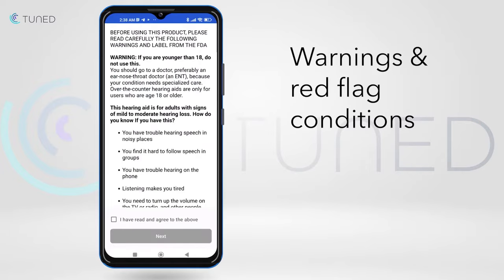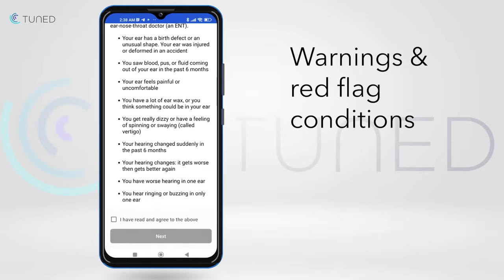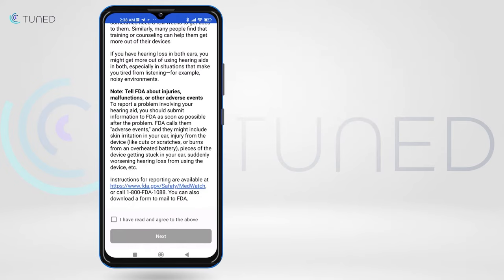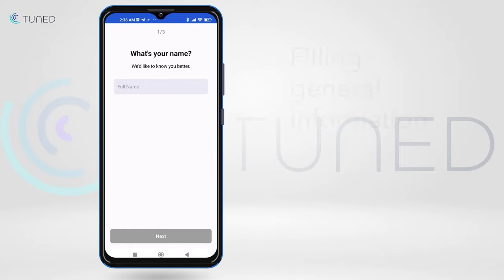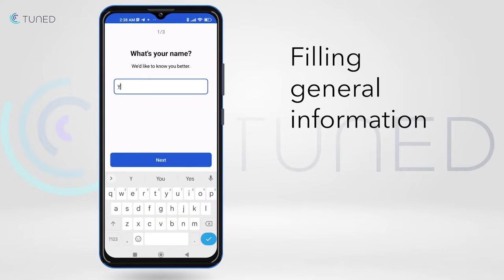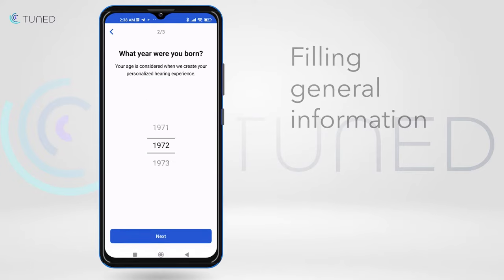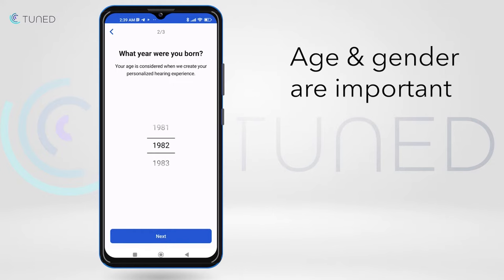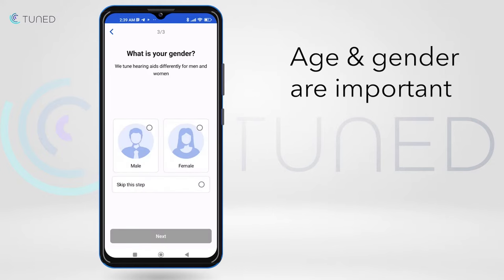Next are the warning and red flag conditions. After the TNC, the app requests some general information. The age and gender of the user affects the initial hearing aid tuning.